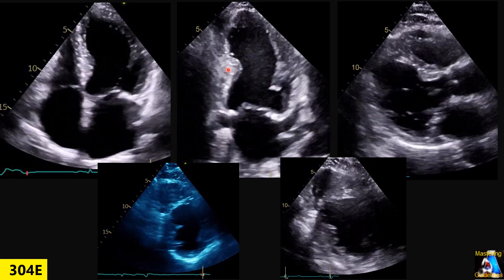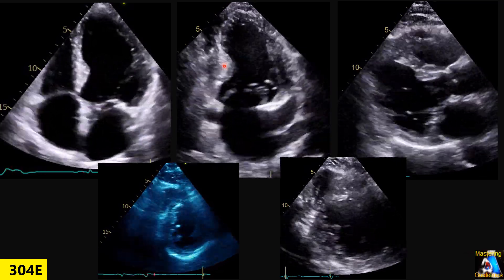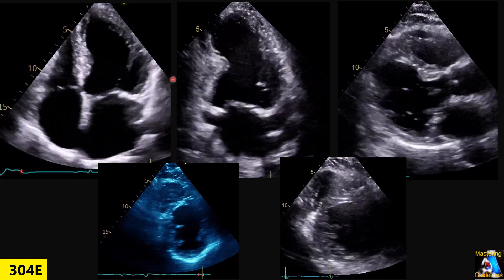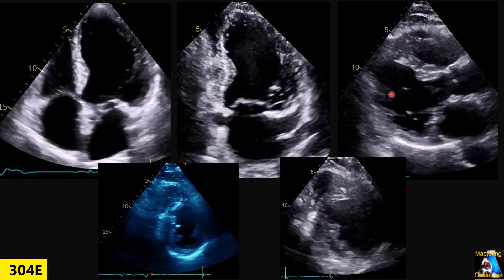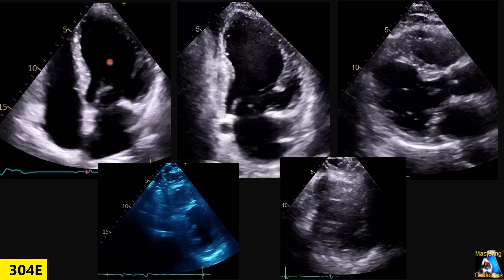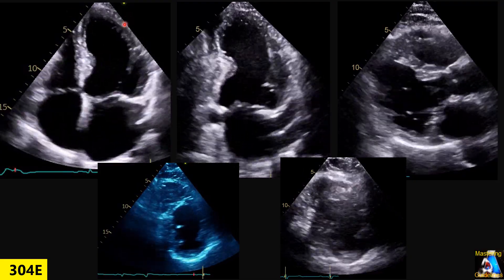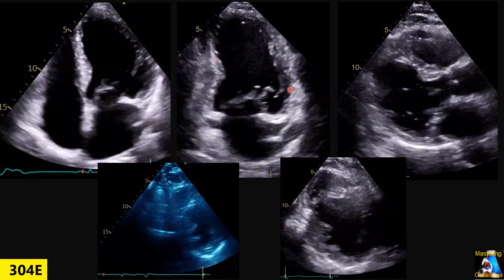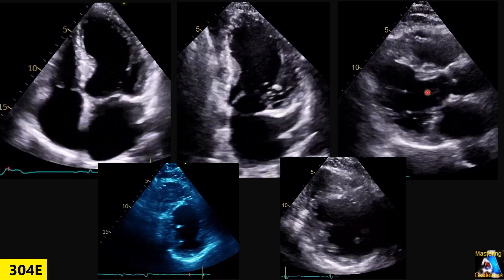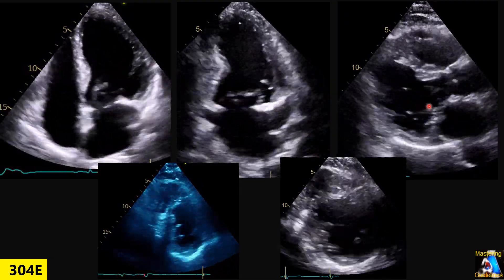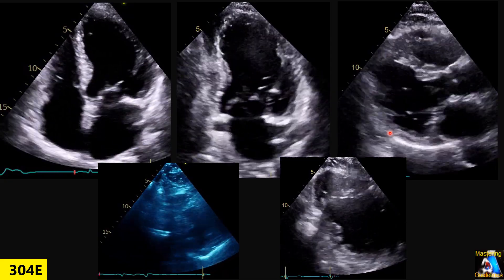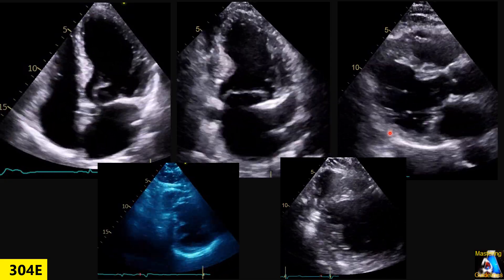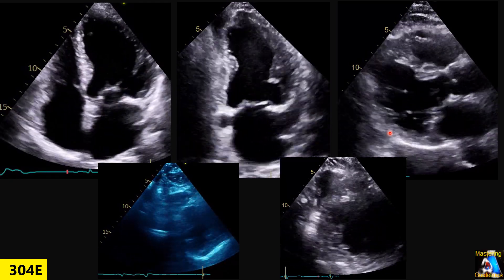Now let's see if the patient has coronary artery disease, especially ischemic or not. As you can see on the apical 4, 2, and PESACs views, we have some abnormality at the apex — thickening at the base, mid, and base is very obvious. If you are not sure, you can pause it frame by frame, go back and forth, and see if that segment is thickening or not.